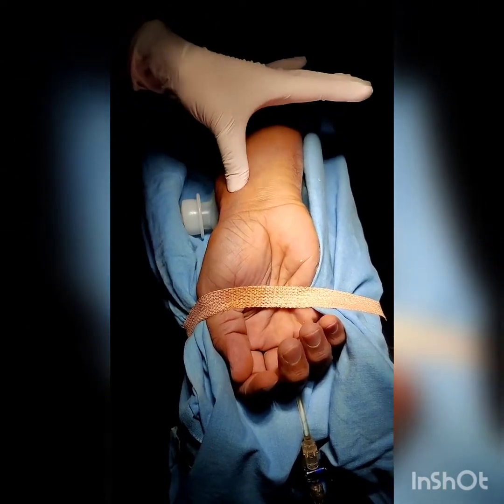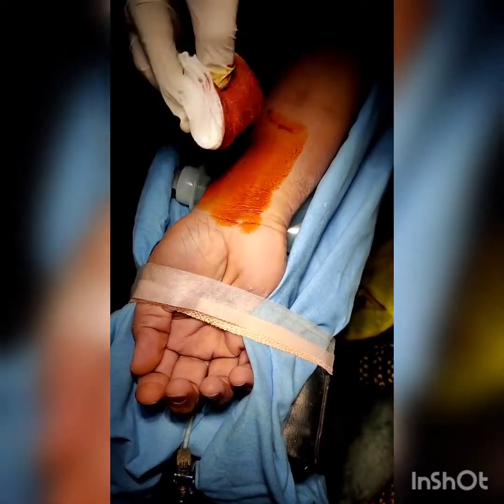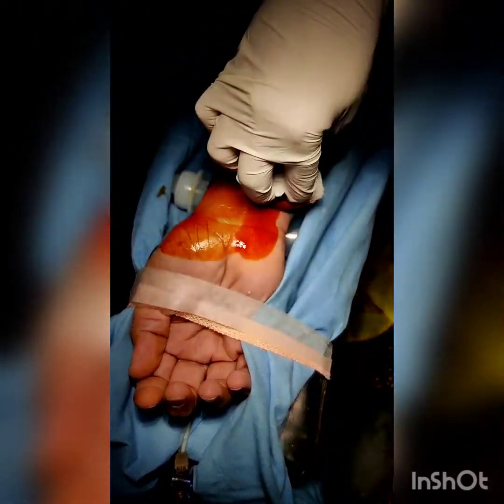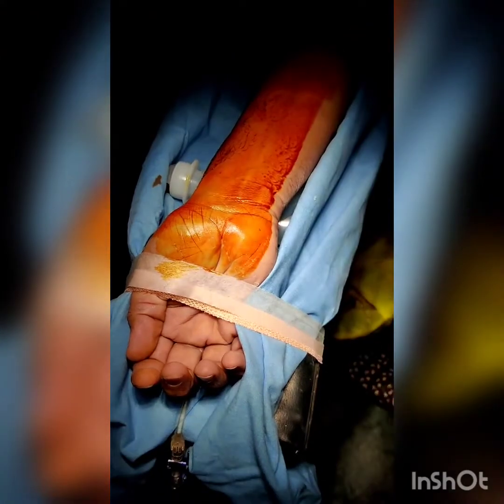Using all aseptic precautions, wearing a sterile gown and gloves after washing up or an alcohol rub, clean the surface with betadine for asepsis. Place sterile drapes all around the puncture site.